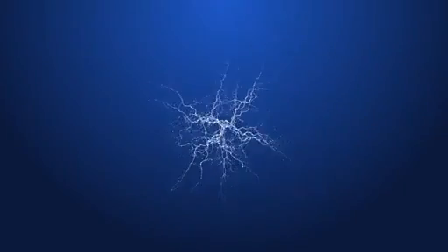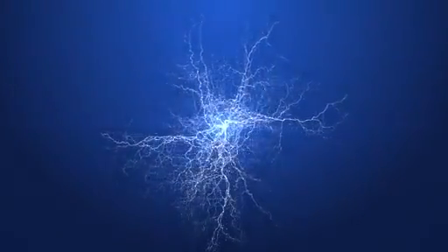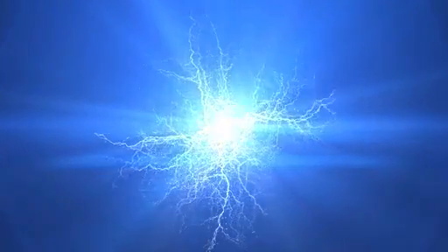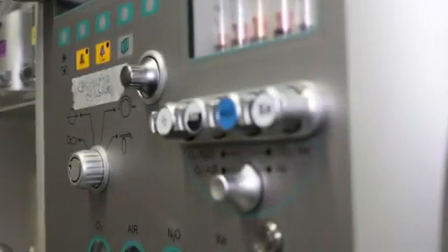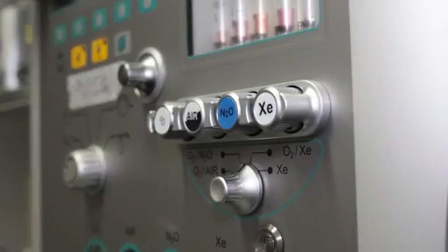The purpose of this experiment is to characterize changes in brain electromagnetic activity in response to the administration of the two gaseous dissociative agents, xenon and nitrous oxide, to healthy participants in a two-way, repeated measures crossover design.